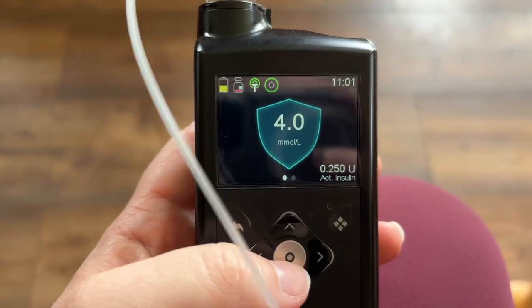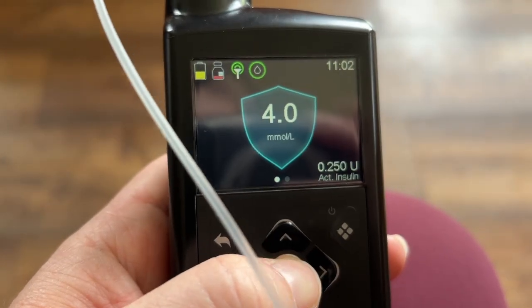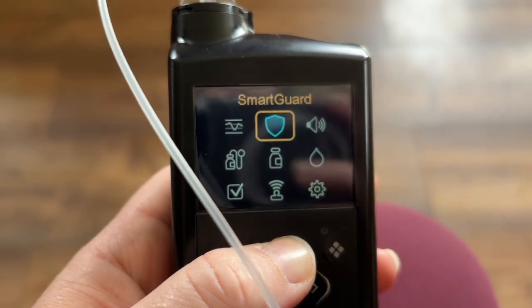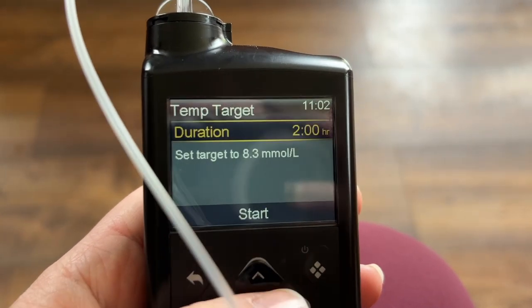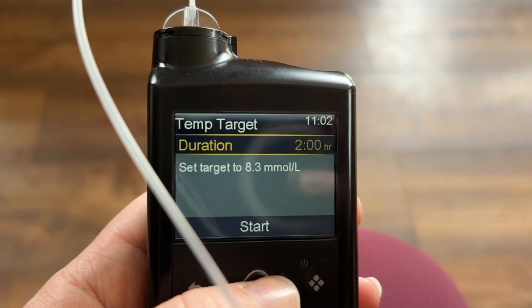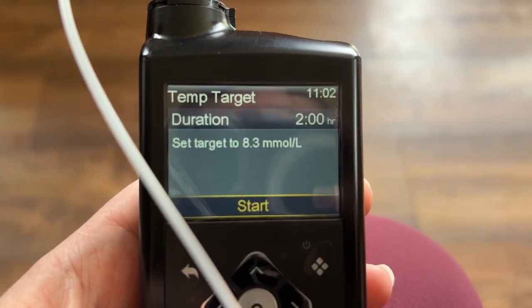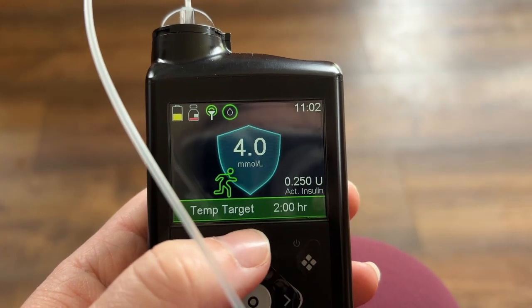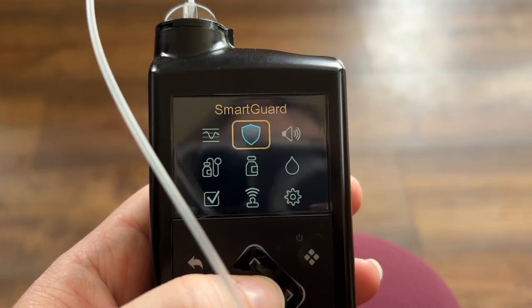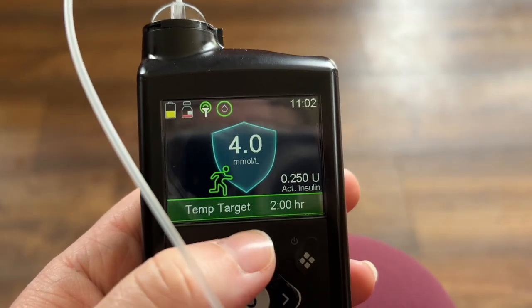Here's my pump — my blood sugar is 4, I have a bit of active insulin on board, and it's 11am. I'm going to go for a walk in an hour. To get to the temp target, go into Smart Guard, click on that, go down to temp target. I want an hour before the walk, about 30 to 40 minutes of walking, and about 15 to 20 minutes after, so I'll select two hours. The target it wants to raise my blood sugar to is 8.3.